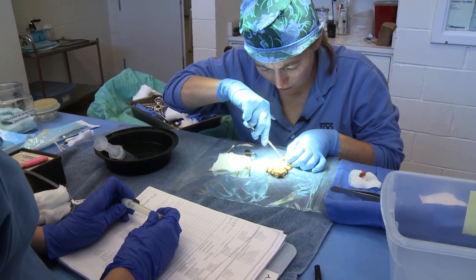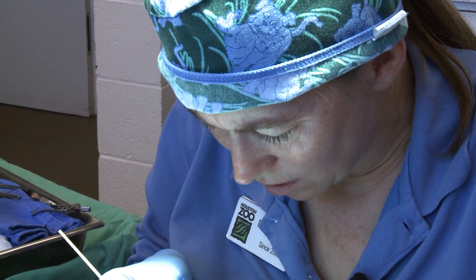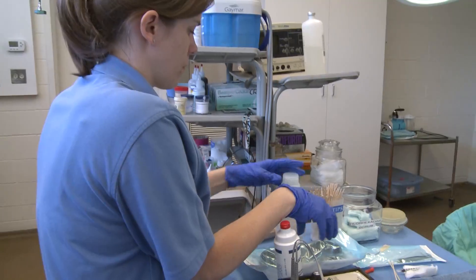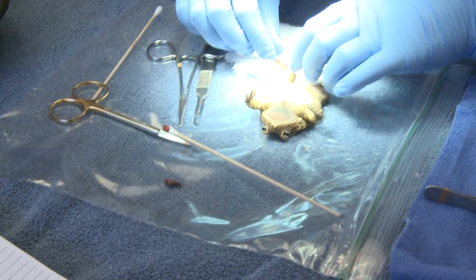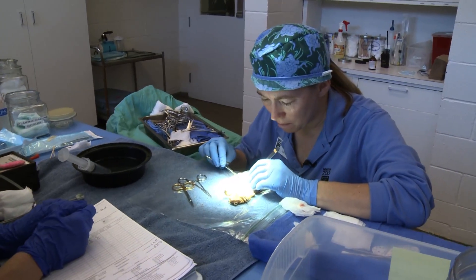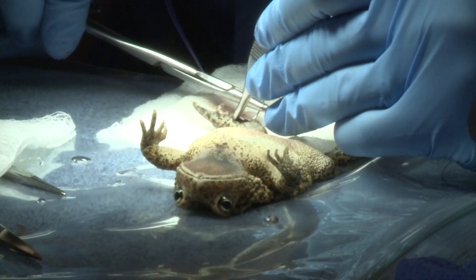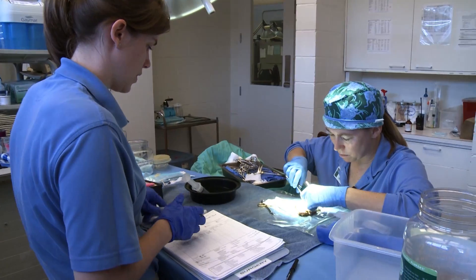A trick in trying to get good margins is leaving enough skin to close — that's going to be the hard part. It looks like it should close up okay. Can you drip sterile saline over him with a syringe? This is part of his ankle right here, so I pretty much disarticulated two of his toes along with the area where the cancer was. Now it's a matter of cleaning this up and closing it. When this heals up he should be able to get around okay — he won't be a release candidate, but in our situation where he doesn't have to hunt much or compete with wild toads, he should do fine.